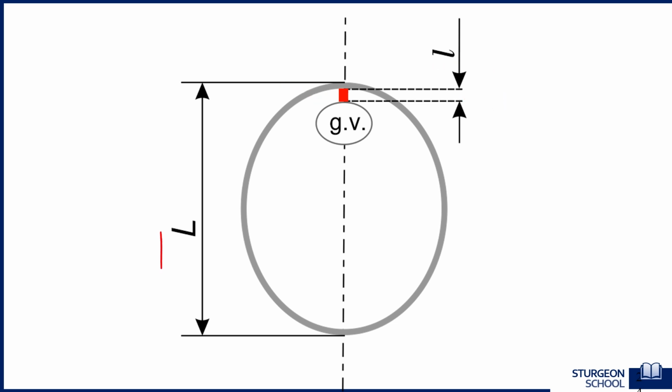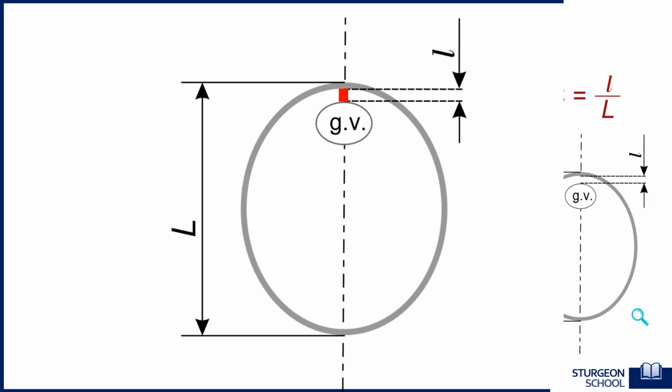Then measure the size of the oocyte in the direction from the animal to the vegetative pole along the outer surface of the oocyte sheath, marked as L large. A very important nuance of measurements is that in the first case, the sheath is not measured, and in the second, measurements are made exactly on the outer edges of the sheath.